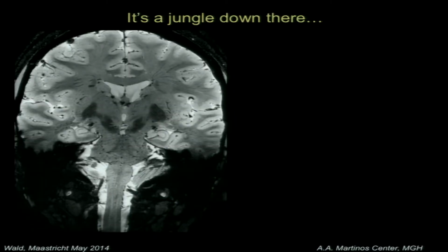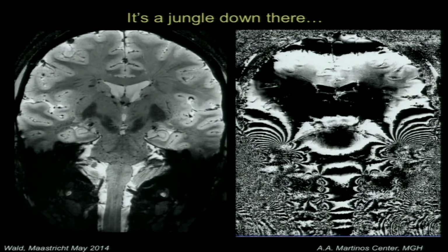Because you look at an image like this and you think, well, that's not so bad. It's pretty artifact-free. True, it's a cardiac-gated image, took a little longer. But you look at the phase map and you see where some of the problems might come from. It's a pretty horrendous shimming environment as soon as you get below the thalamus. And above the thalamus, it's quite fine. So we're going to need some improved shim technology to make images down here that look as good as up here.